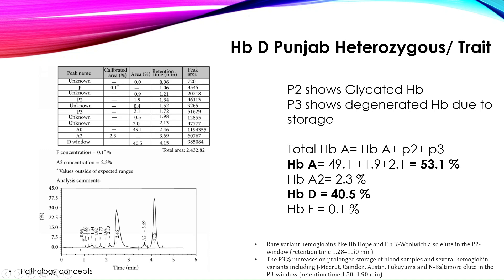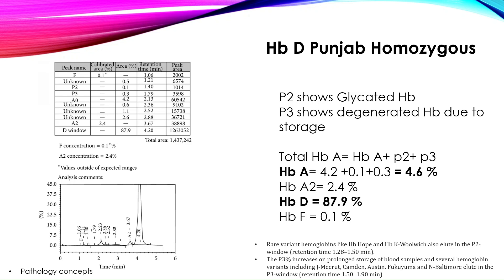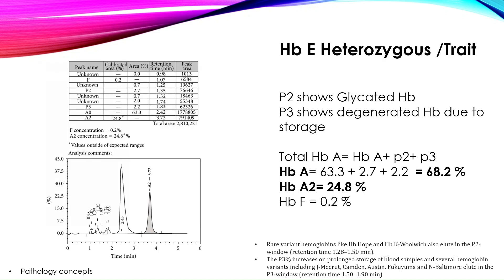Now let's see HbD Punjab homozygous. Here HbA is very low at 4.6%, HbA2 is 2.4%, and the majority of hemoglobin is HbD Punjab at 87.9%. In homozygous disease, hemoglobin D is the major hemoglobin, consisting of more than 80% of total hemoglobin.